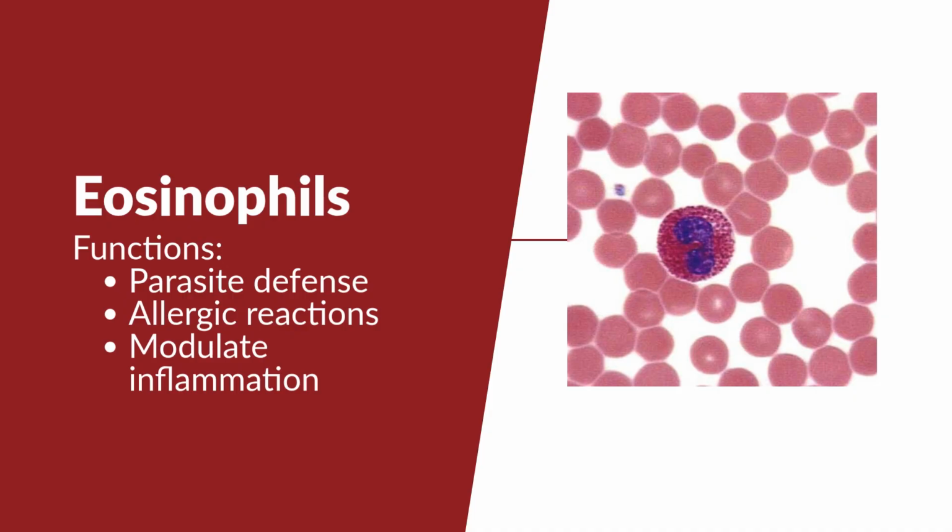This makes the eosinophil one of the easiest cells to recognize and differentiate. An eos response is the body fighting parasites or overreacting to allergens. Remember, that will help you connect morphology, function, disease association, and differentiating between the interpretation. All right.